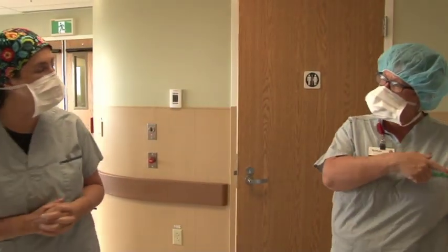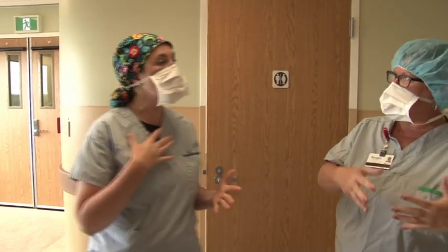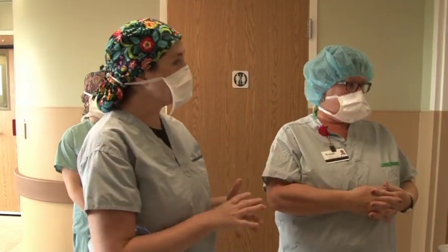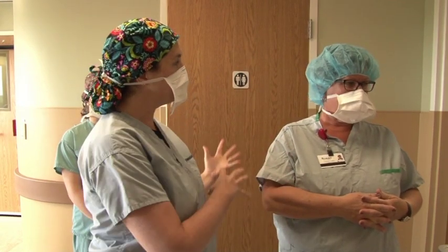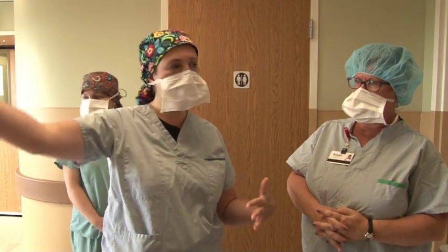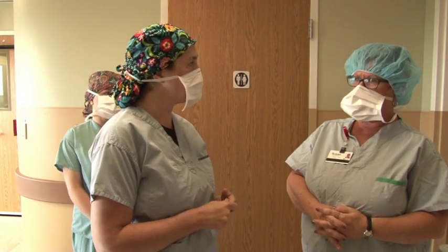And do you as a nurse do that? Yes, as a nurse we prepare our trays. We have them all cleaned, ready to go down to SPD. And at the end of the day, SPD come up and take our trays down and have them cleaned and re-sterilized. And then they're brought back to us, and everything clean and re-sterilized is kept in our procedure room.